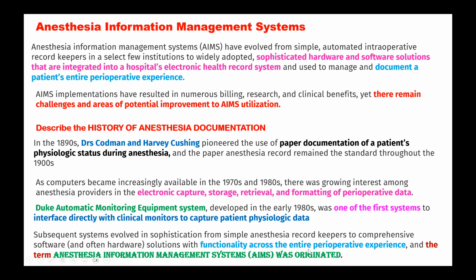So from just the documentation of vitals during the intraoperative period, because the hardware and software of computer systems became available, by interfacing with your preoperative records as well as the intraoperative monitors and in the postoperative period, the term anesthesia information management system was coined and started being used.